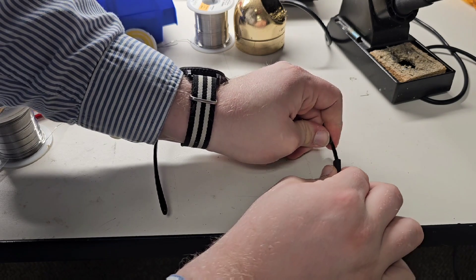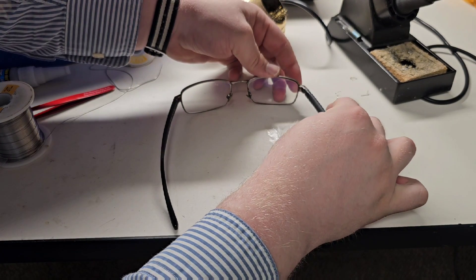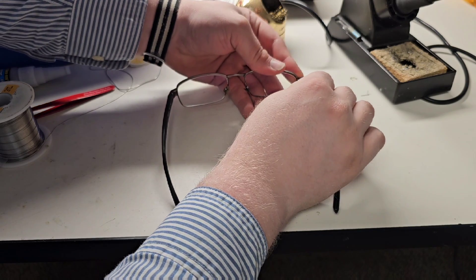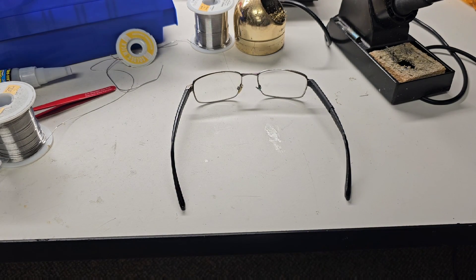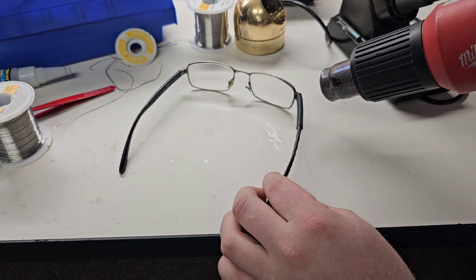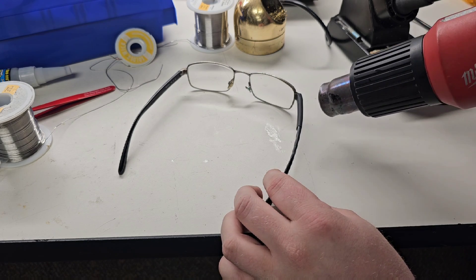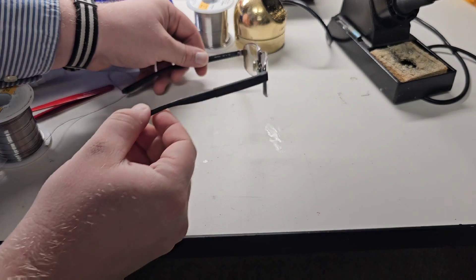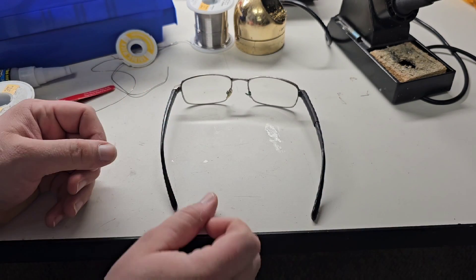You want to make sure it's tight — you don't want to use stuff that's too loose. We're going to slide it up real tight over the edge right there, just like that, and then grab the heat gun. And there we go — a beautiful glasses repair that won't come out, and that is how an engineer does it.